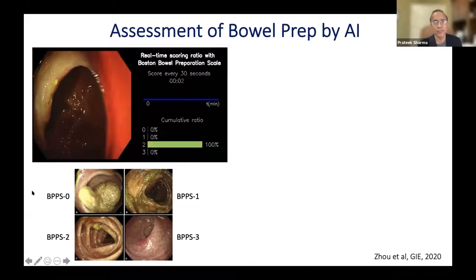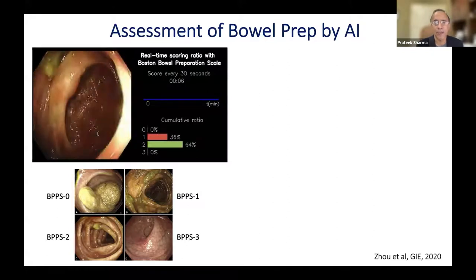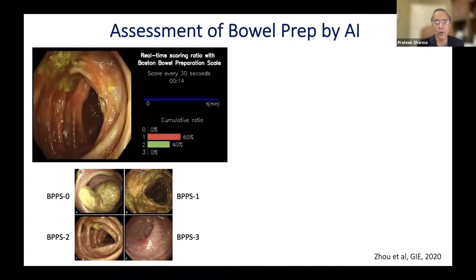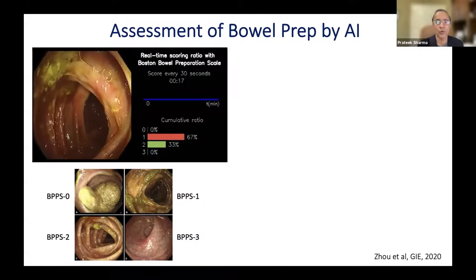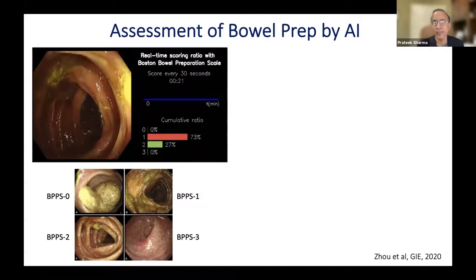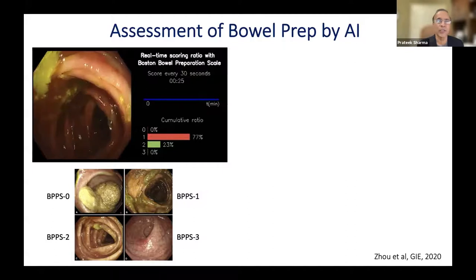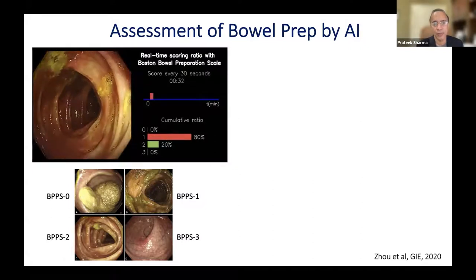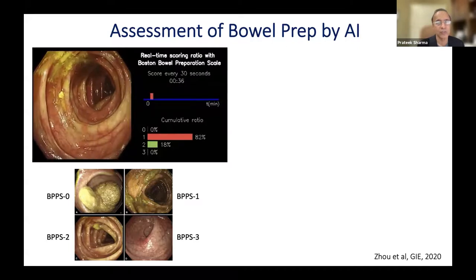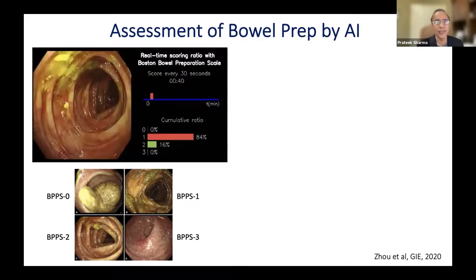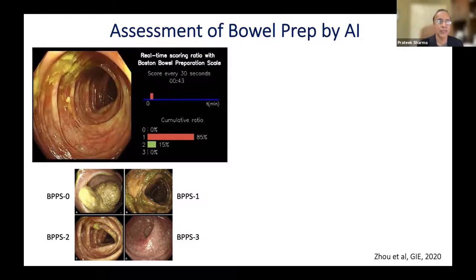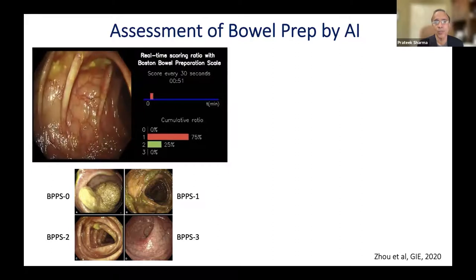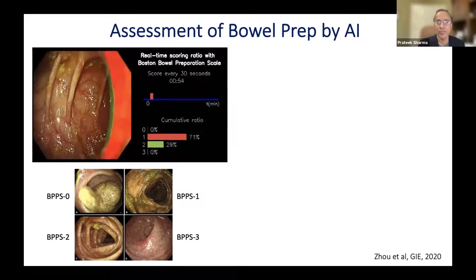This shows real-time assessment of bowel preparation. We assess bowel prep using the Boston Bowel Prep Score, which runs from zero to three — zero being worst and three being best. Rather than the physician trying to grade it manually in the report, this can be automated. As withdrawal happens, the computer grades it in real time as one, two, or three, and shows what percentage of the bowel wall corresponds to each score.